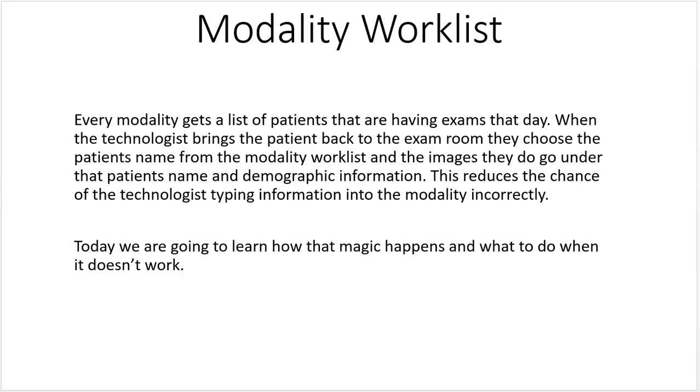In RADI 100, your DICOM course, we talked about DICOM Modality Worklist, but we also need to talk about Modality Worklist from the HL7 side of things. Every modality gets a list of patients that are having exams that day. When the technologist brings the patient back to the exam room, they choose the patient's name from the Modality Worklist, and the images they do go under that patient's name and demographic information. This reduces the chance of the technologist typing information into the modality incorrectly. Today we're going to learn how that magic happens and what to do when it doesn't work.